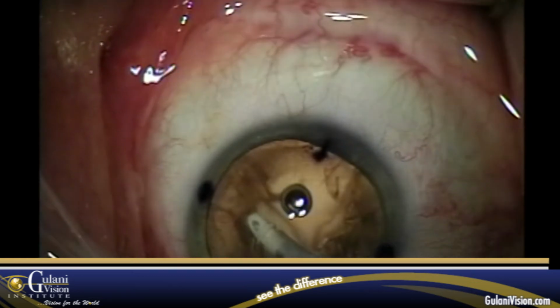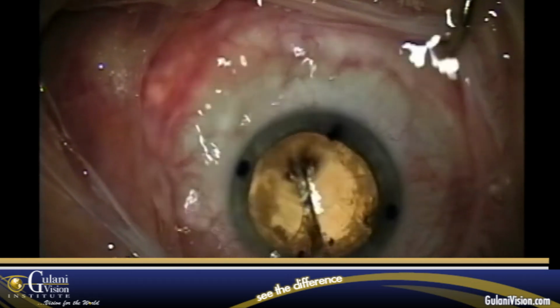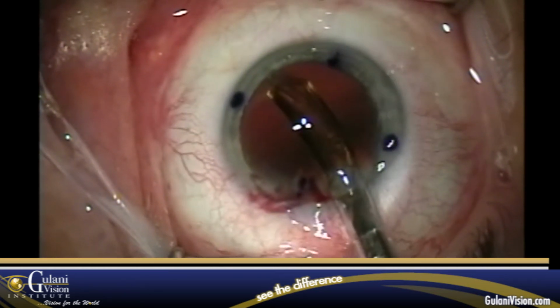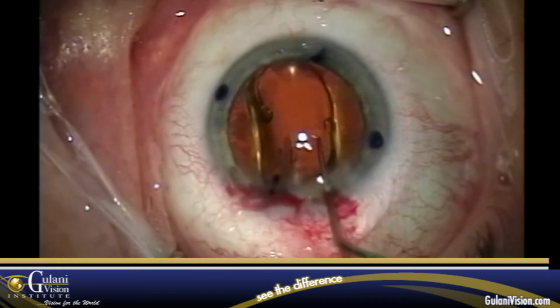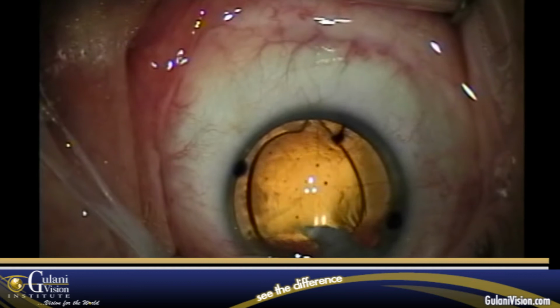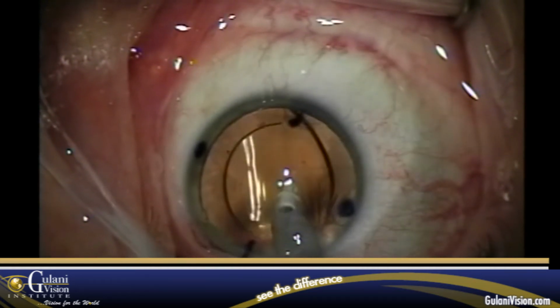Same principles for IA. Notice the poor reflex. Do not worry about the subincisional cortex. In these cases, I like to inject the lens first, manipulate it under the cortex, and then bravely step on the irrigation aspiration and get the cortex using the lens platform as your diaphragm.